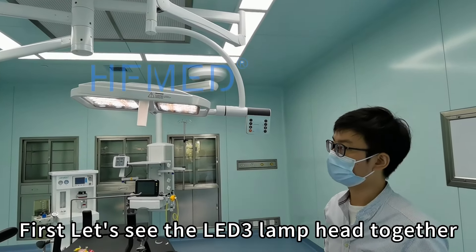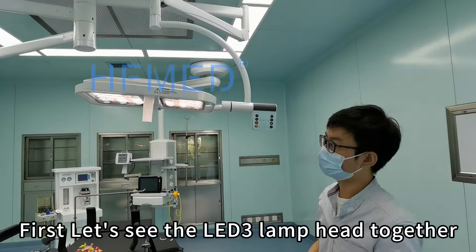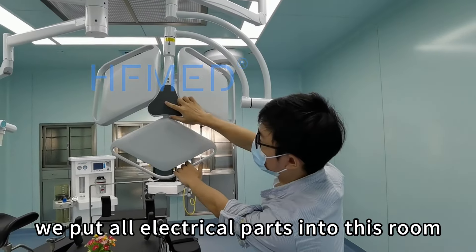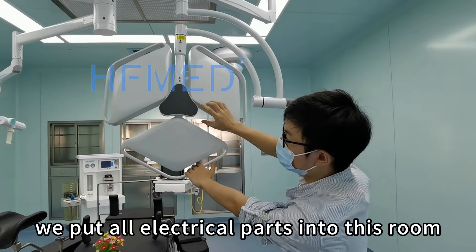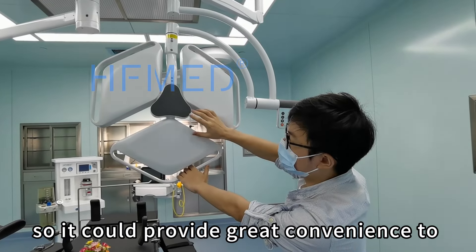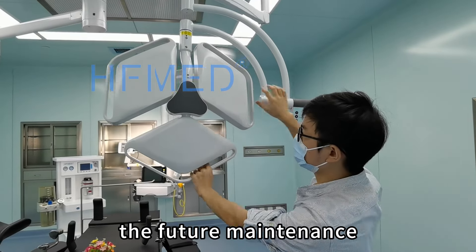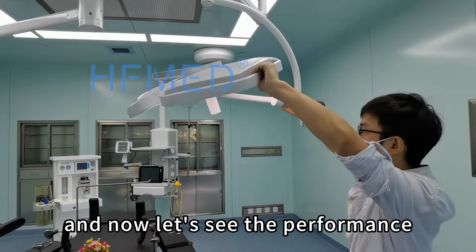First, let's see the LED3 lamp head together. Due to the unique design of the lamp head, we put all the electrical components into this unit, so it could provide great convenience for future maintenance. And now let's see the performance.